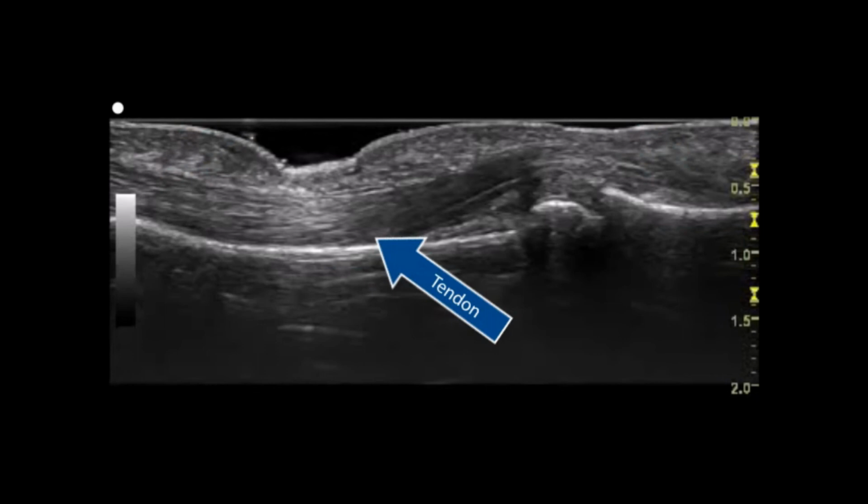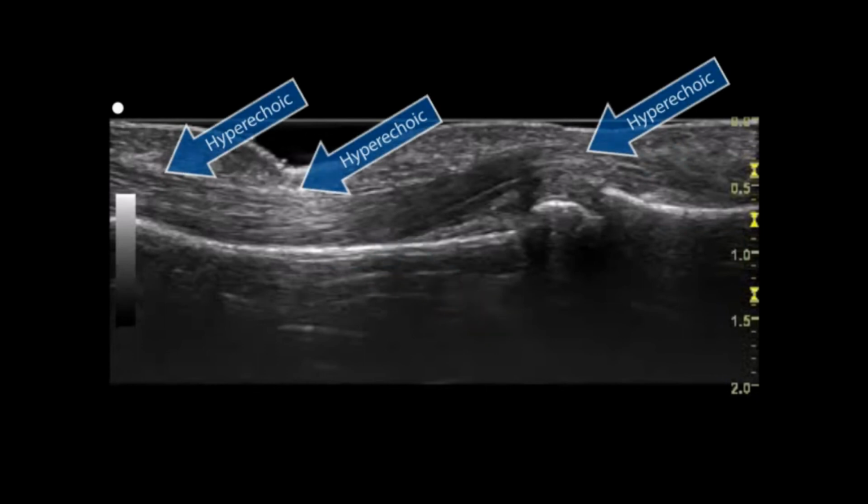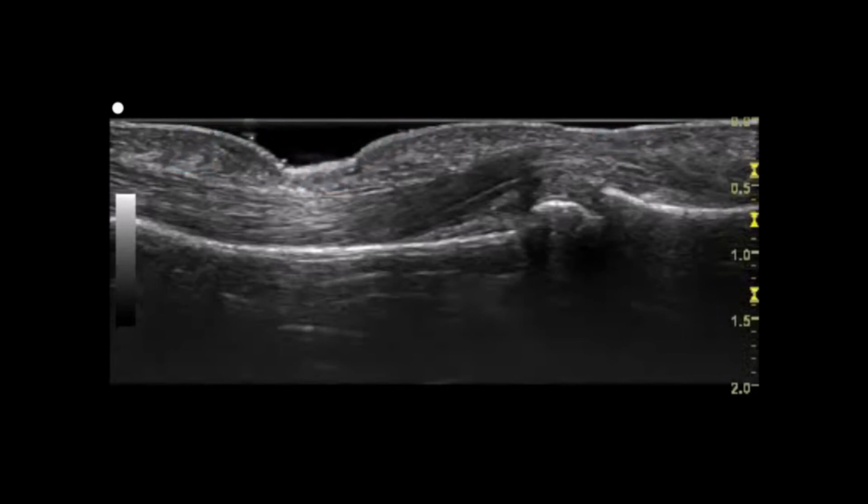Along most portions of that tendon, the tendon is quite hyperechoic, as one can see its linear striations. But as one gets to the edge of this tendon where the transducer is no longer aligned in a perpendicular orientation over the tendon, a false hypoechogenicity or anisotropic artifact is created.